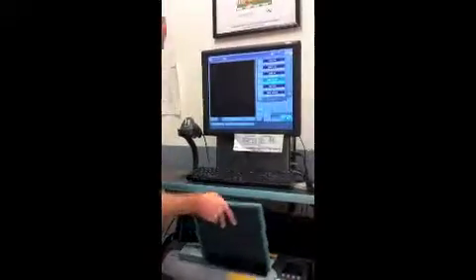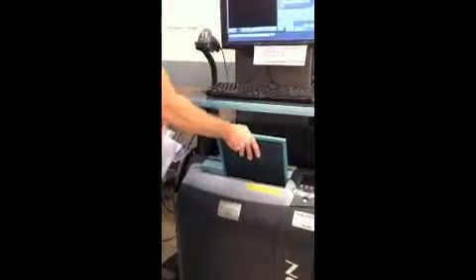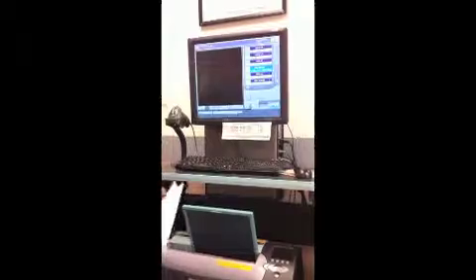Bring up the study you were in. And with all 7, I only have 1 for purposes of brevity, but for all 7, you select the procedure you took. You take the barcode and scan it to electronically link them, and then you run the cassette. Then the image will come up, all 7 will go up there, and then you'll do your PAX and Meditech thing.